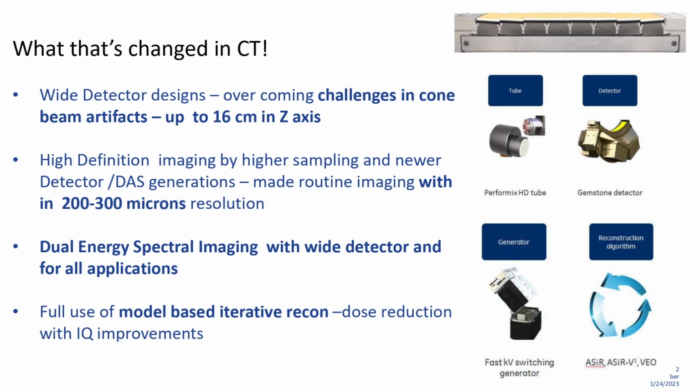The advantage with this wide detector is, one, it needs less scan time. When scan time is less, invariably motion artifacts will be less, and that enables you to do better cardiac studies. The detector makes the essential difference here in wide detector CT.